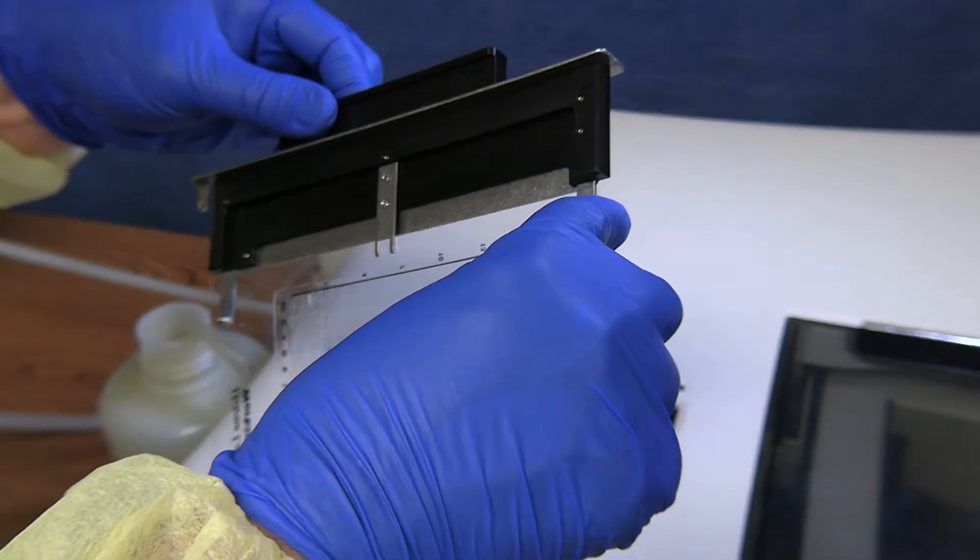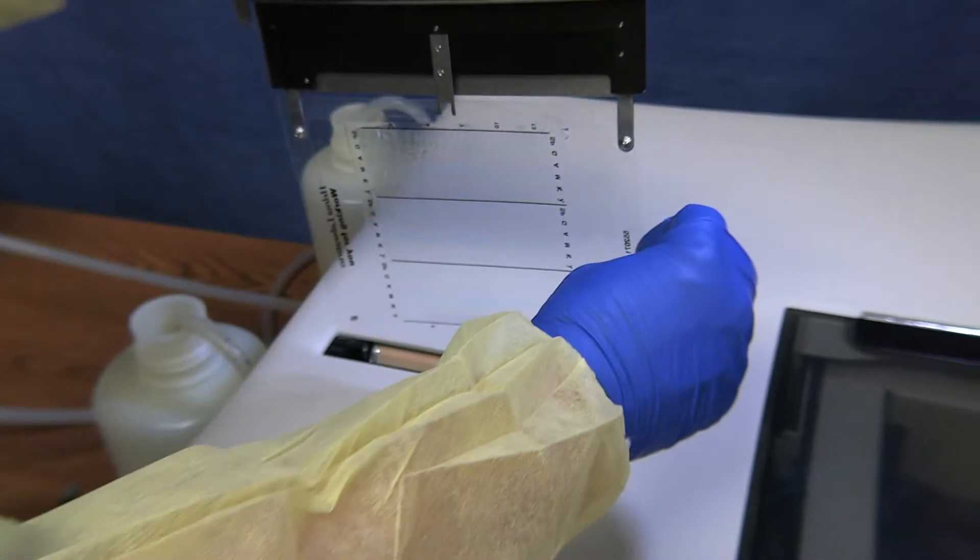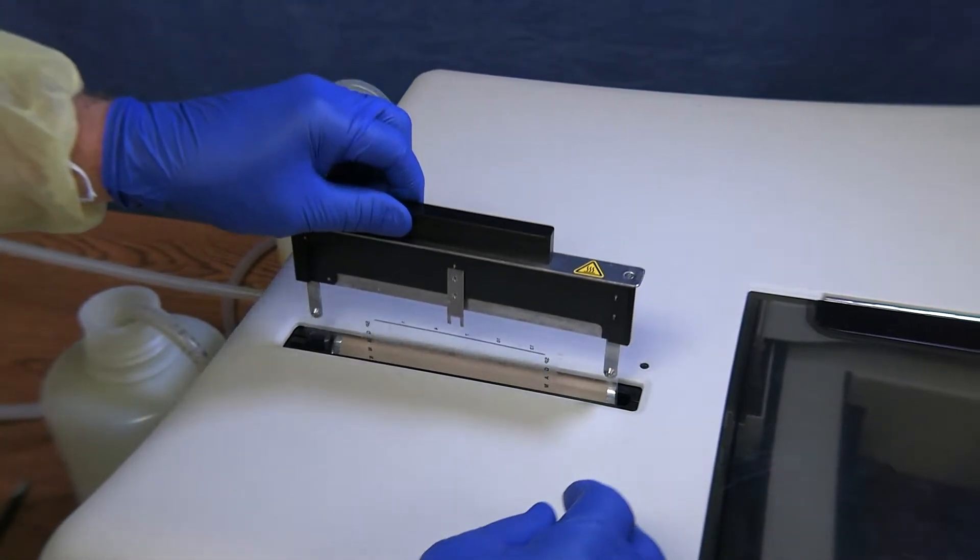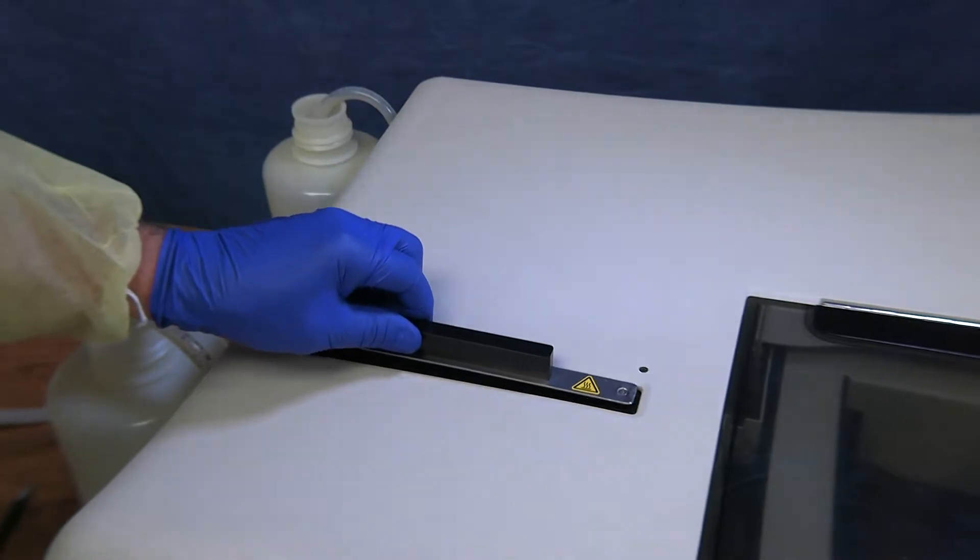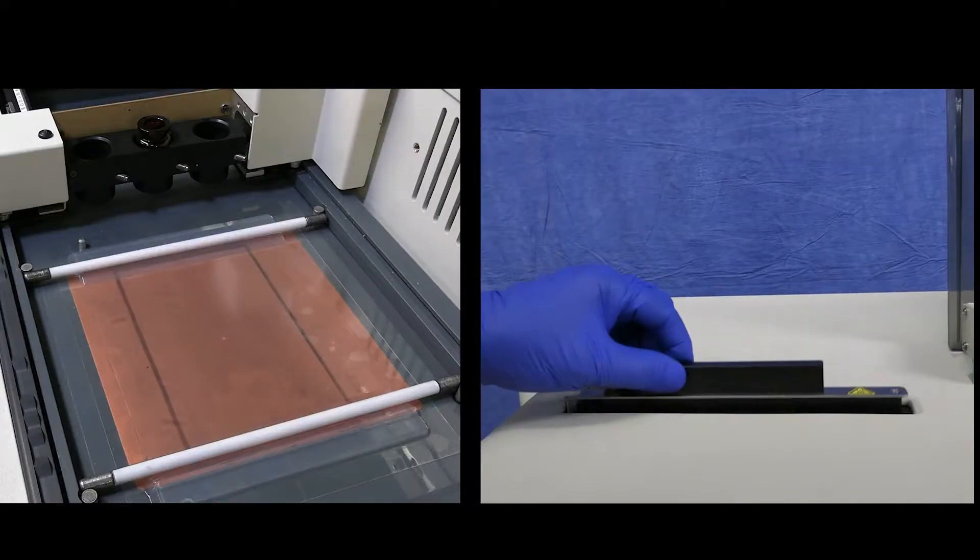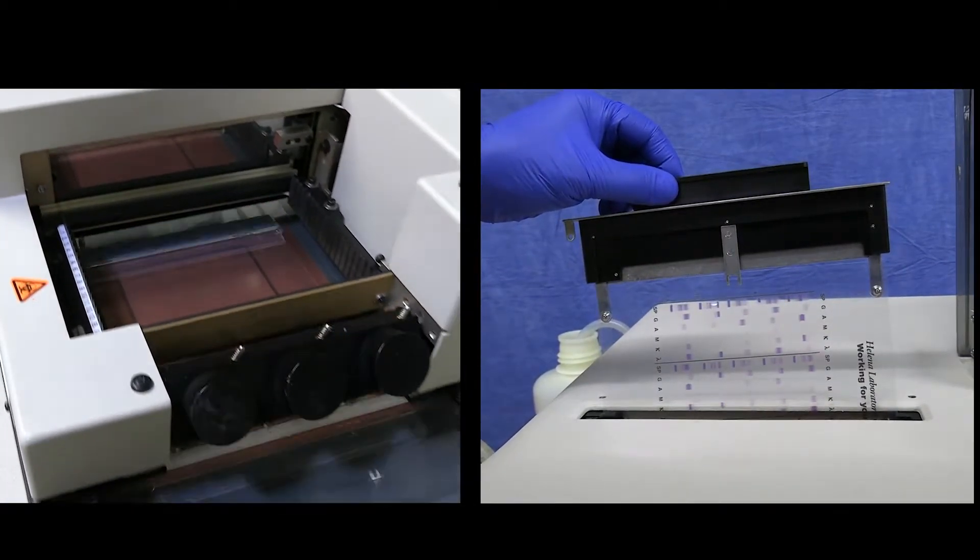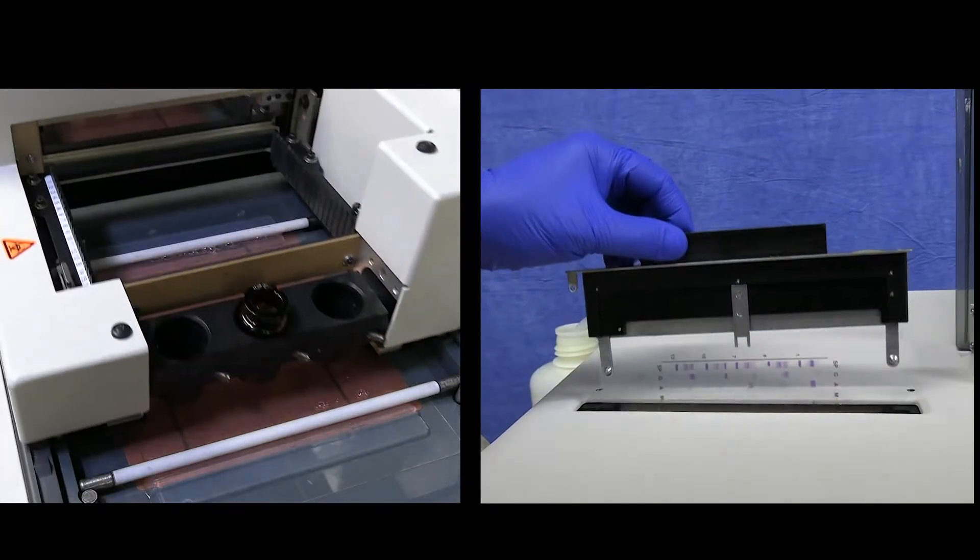For directly stained procedures, the operator transfers the gel to the left side of the instrument where all steps of washing, staining, destaining, and drying are automatically completed. That means one gel can be in electrophoresis at the same time a different gel type can be washing and staining.